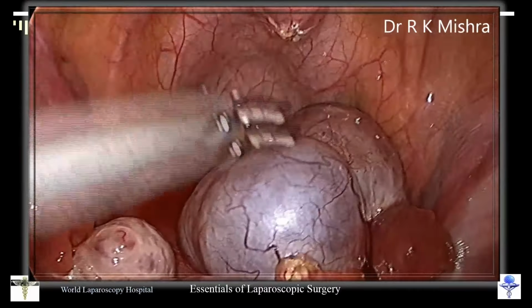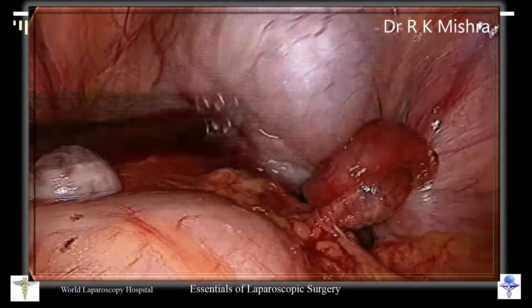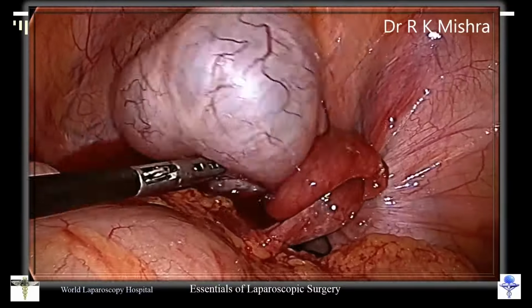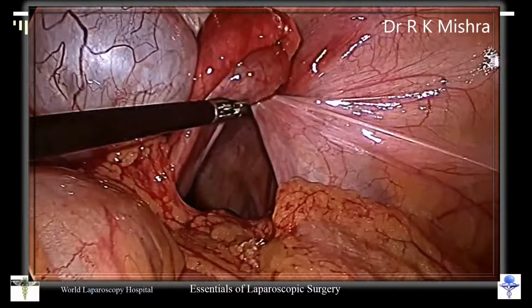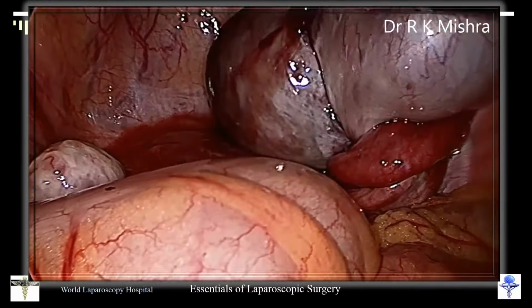So, this is all around, and here is a tubo-ovarian mass with torsion. So, you have to detorse it. In the old books detorsion was not allowed, because of the toxic substances that would enter the circulation, but here we do not do this.